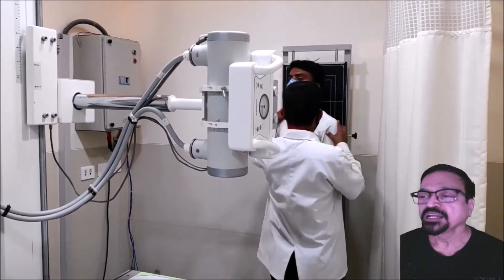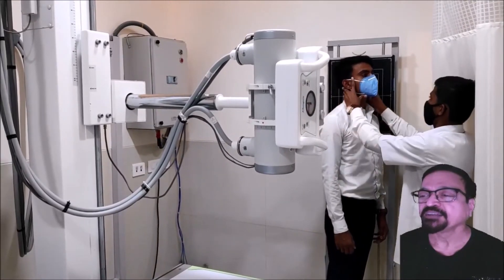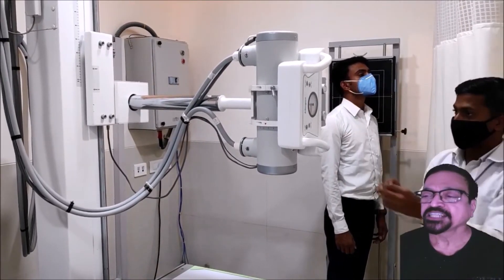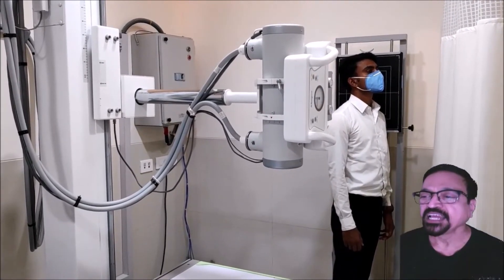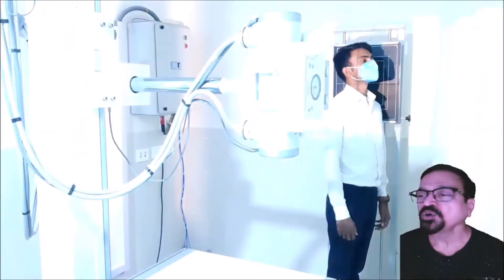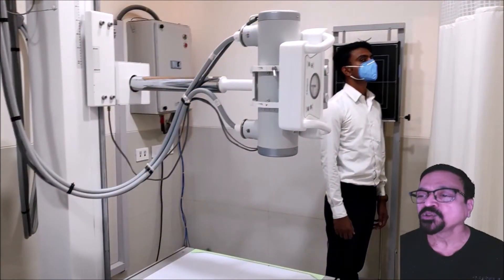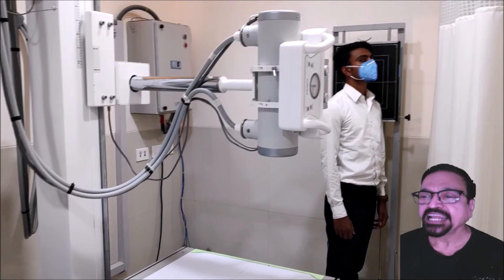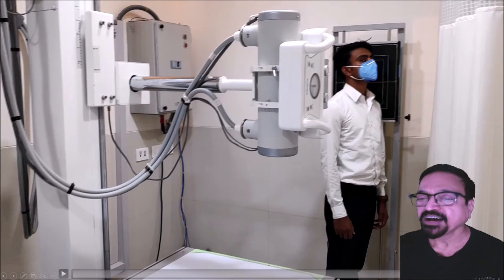The advantage of the erect or standing position is that you can take both projections in the same session. If you want to take a lateral as well, you can do so in the same way — you can take the lateral and both obliques. If the patient is standing, it is very easy, very convenient, and fast for turnover.